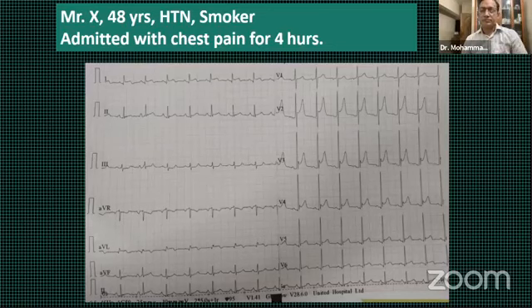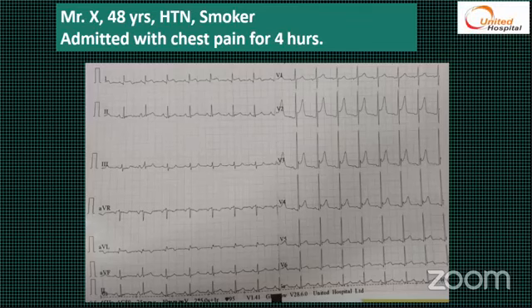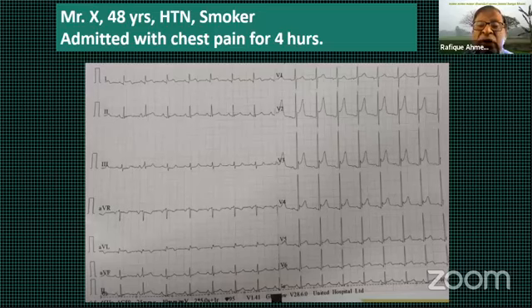Okay. So as Hafiz mentioned, there are only 3 diagnoses. Hafiz did not want to mention the third one, but I have to. First, acute myocardial infarction is important because that can kill the patient. Second is pericarditis. That can also kill the patient because if I give heparin or a thrombolytic, they can develop tamponade. And the third one will be early repolarization. So let's go through the first, second, and third: acute MI, acute pericarditis, and early repolarization.